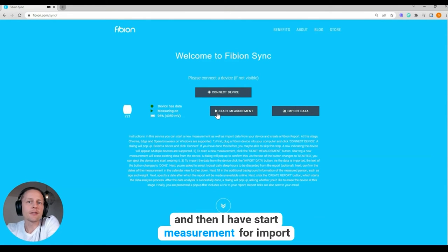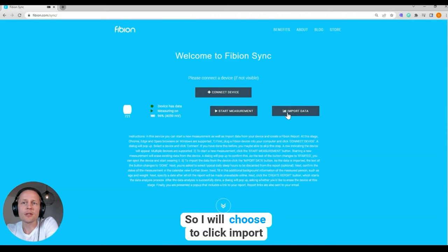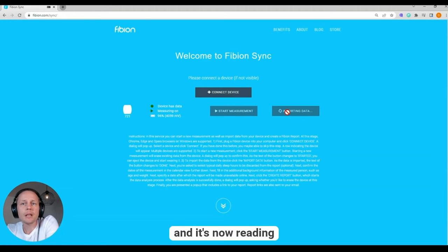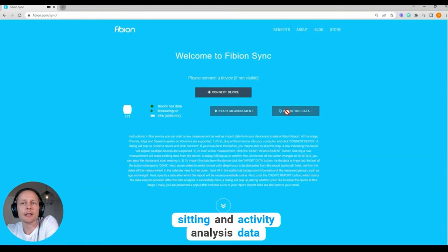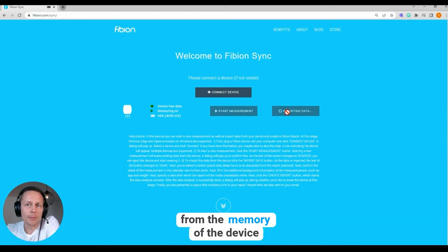Then I have the options to start a measurement or import data. Since I have already done the measurement, I will just click 'Import Data.' It's now reading the sitting and activity analysis data from the memory of the device.